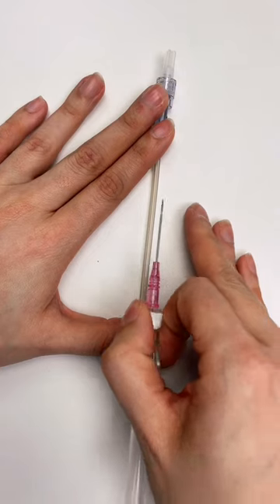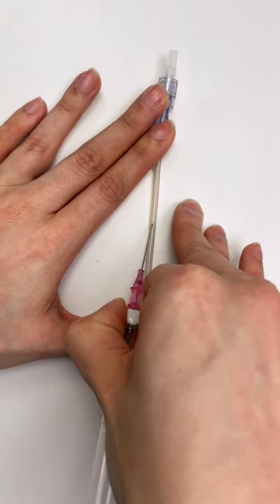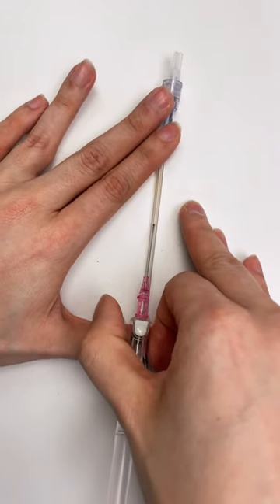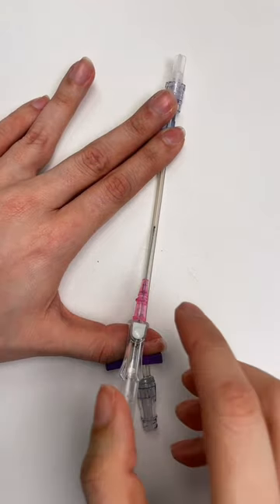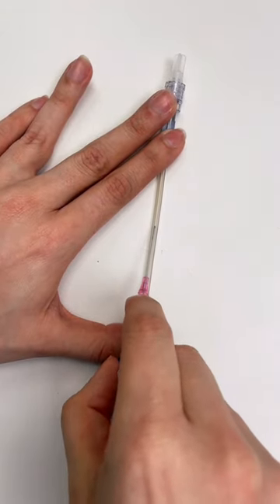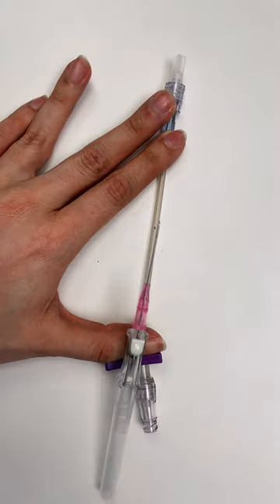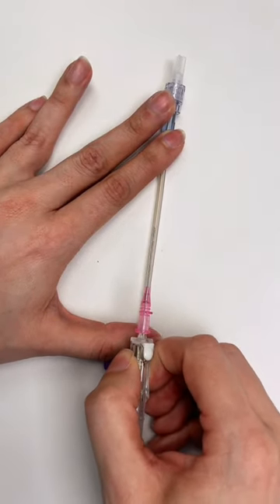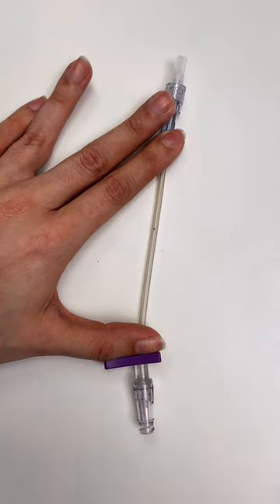Okay, here is my vein and I go to start and I pierce through and I get flashback right now. Right now I'm getting flashback because the bevel of the needle is inside the vein, but the catheter isn't. So if I try to advance this catheter right now, I'm getting a lot of pushback and resistance. And what would happen in a real patient's vein? Well, that could happen, but also the catheter could destroy that vein wall with too much pressure from me trying to push it off.